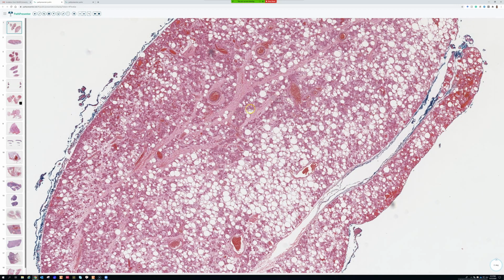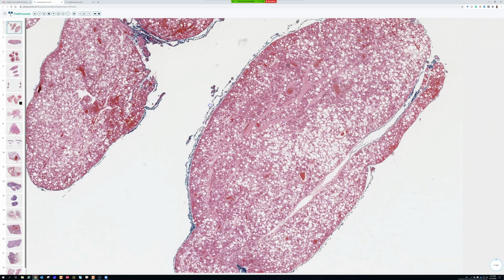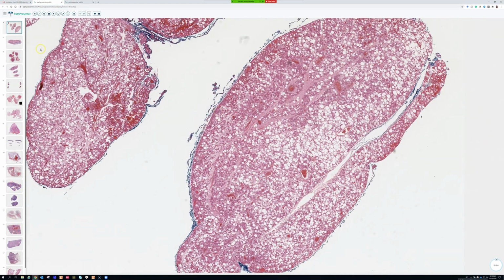There are rare times you can see brown fat. I've heard that it can happen in well-differentiated liposarcomas. I don't think I've ever seen one yet that has it, but people who trained me told me they've seen a few. And then also, I have seen sometimes in the high-grade form of myxoid liposarcoma, you can have brown fat differentiation. I've seen that like once or twice. But otherwise, when you find this, I mean, these are benign, and you're done. The diagnosis is there. Hibernoma, and that's just a real beauty. I can't look away. It's so good.